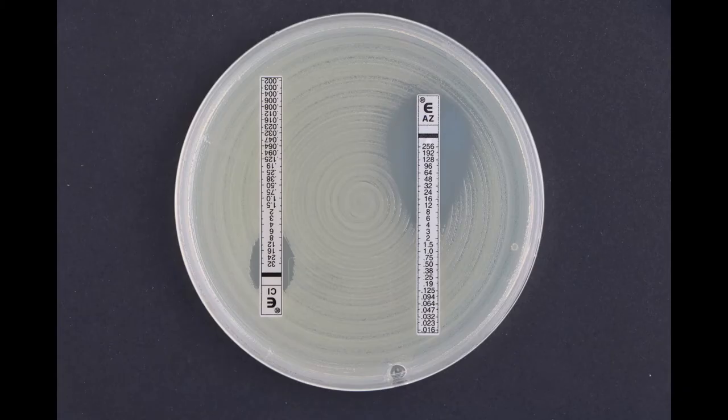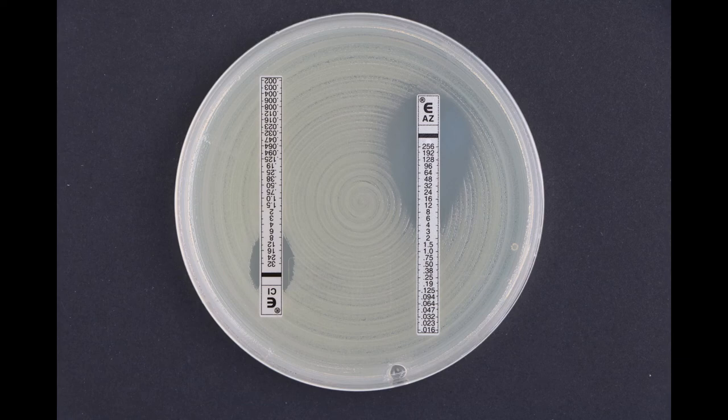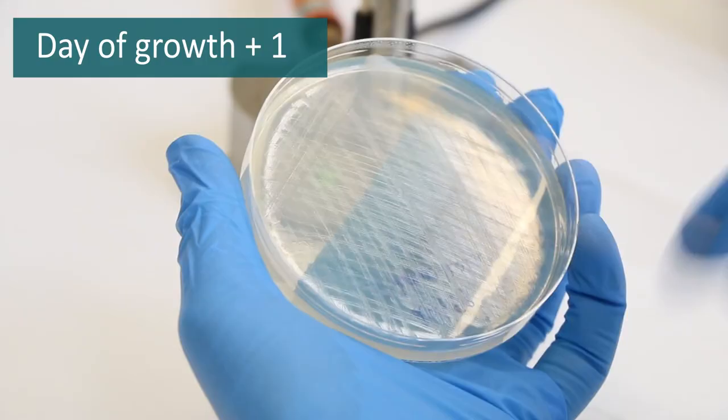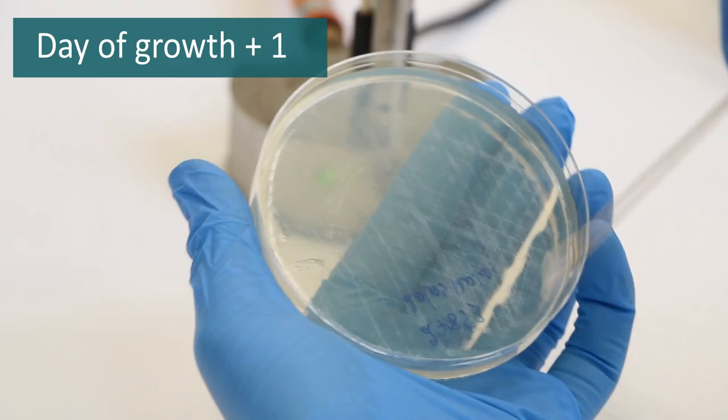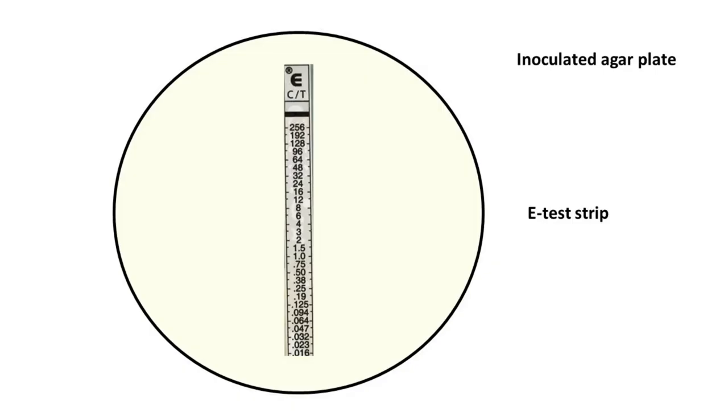The e-test is a method based on a combination of dilution and disc diffusion. It determines the minimal inhibitory concentration of a particular antibiotic. Similar to disc diffusion, a standardized suspension of the bacterium is spread on the surface of a specific solid culture medium. Next, instead of a disc, a thin strip impregnated with a dried exponential gradient of the tested antibiotic is placed on top.